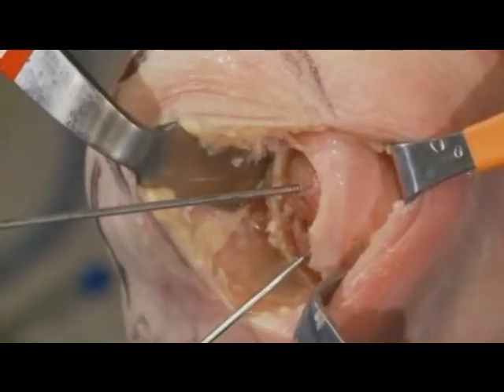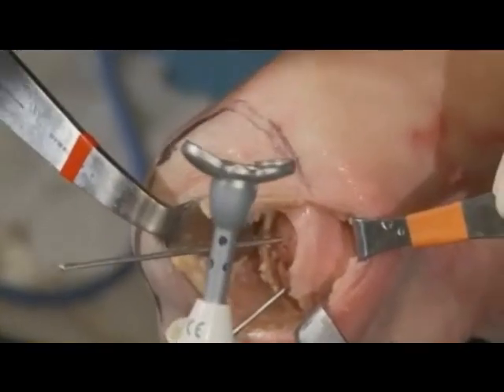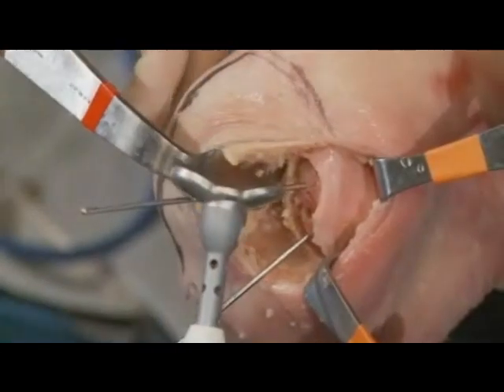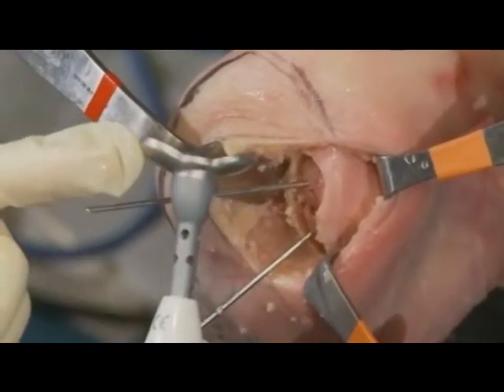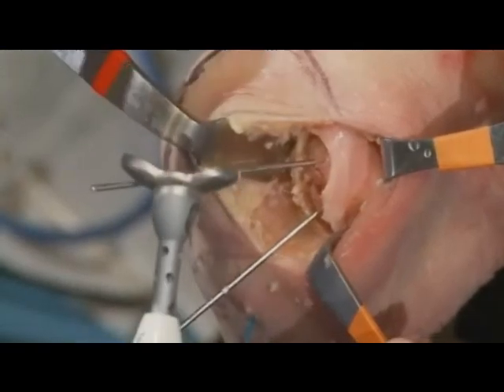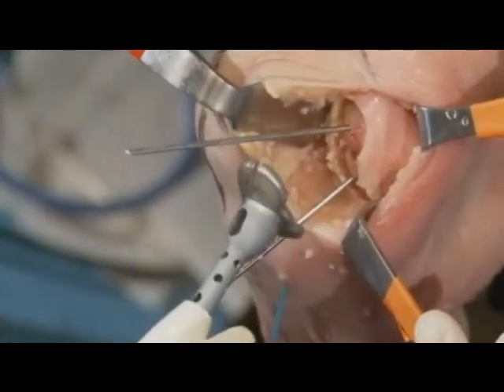All right, so now we're ready for our trial implant. The trial, you can see here, is a little bit asymmetrical, so that the posterior portion, which is the flange, is right here. That's because as you get a little bit further back, the cartilage and everything gets a little bit thicker back there, so we make the posterior flange a little thicker to match the anatomy of the patient.